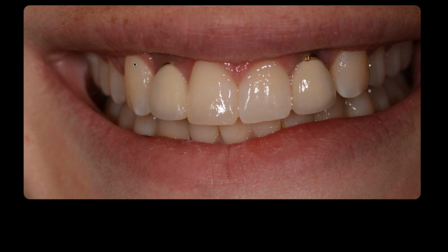And when she smiles, she's a young lady and she's got a high smile, and it's kind of ugly. She's got some spacing issues too, which I'm going to get into. And you notice that the canines are not symmetric. One is turned in on her right, your left, and on her left, your right, you see it's turned out. That's more of a male tooth, so we don't want that. But you see there's some asymmetry in the arch.